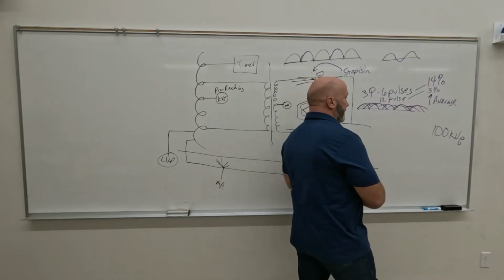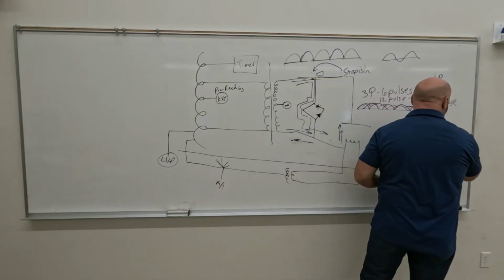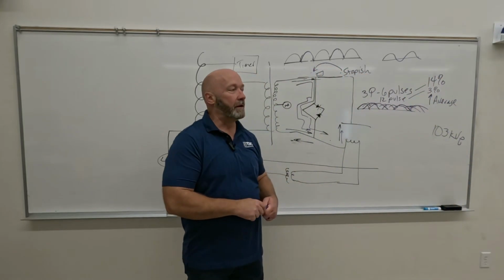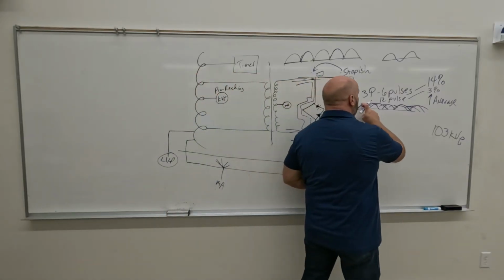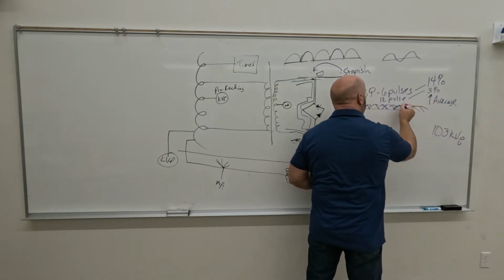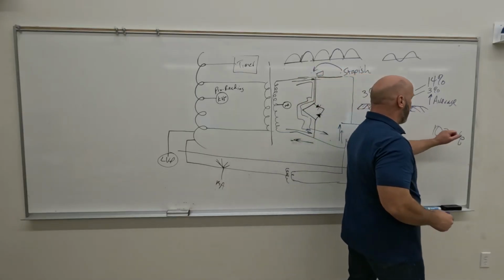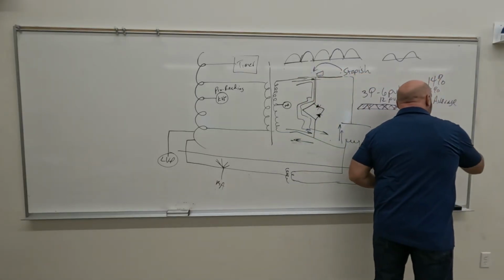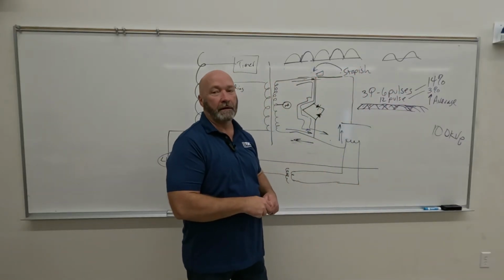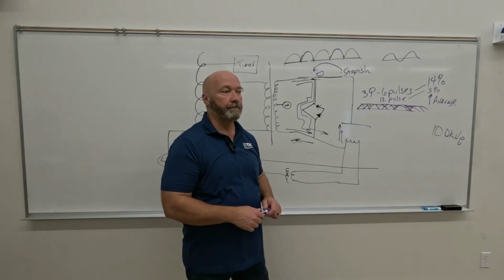So what if then we did this? You set 100 kVp and it actually gives you 103. Well, if it gives you 103, what we then do is come through and we knock the peaks off at exactly 3%. What do I have? 100 kVp. And what's our voltage ripple? Very close to 0. So it's less than 1%. You knock that margin of error out.